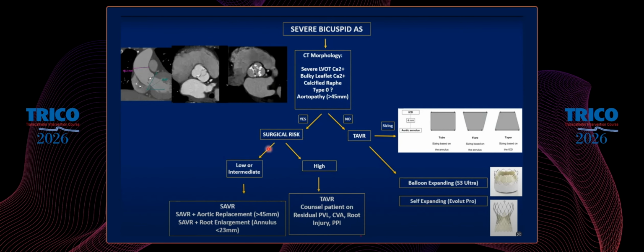If surgical risk is low or intermediate, then you can send the patient for aortic valve plus root repair if there is aortic dilatation, or you send the patient for aortic valve replacement and make sure that the surgeon does a root widening, especially if annulus is less than 23 millimeter. If surgical risk is high and you are considering TAVR, you have to counsel the patient about residual PVL, its consequences in the long run, risk of stroke, root injury, and conversion to emergency surgery. If you are considering TAVR, you can then think about a self or balloon expandable valve based on the indication.